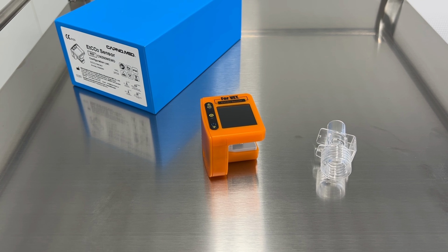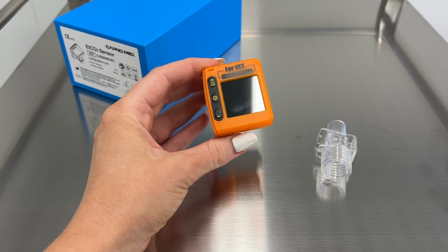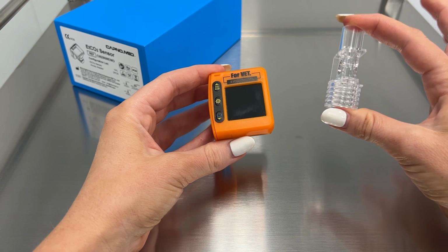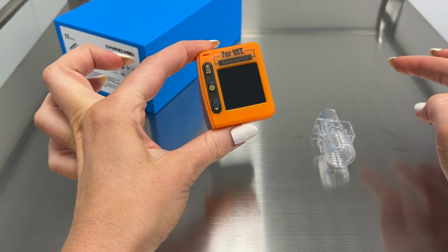In this video, I'm going to go over the basic setup of your brand new MEMO end-tidal CO2 sensor. In regards to attachments that come with the sensor, this is your airway adapter that will insert into the sensor, and this is the sensor.